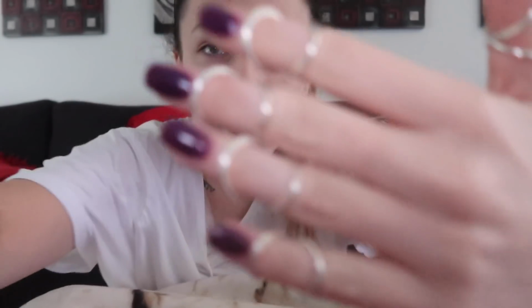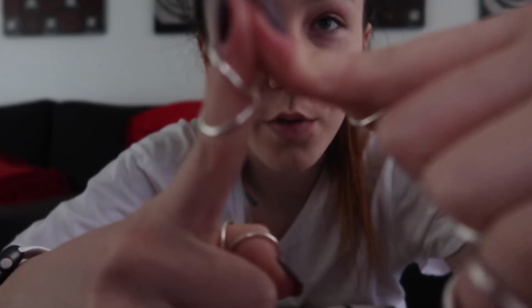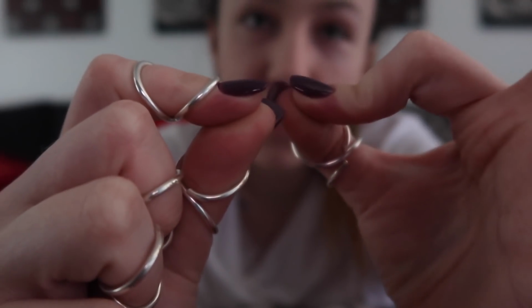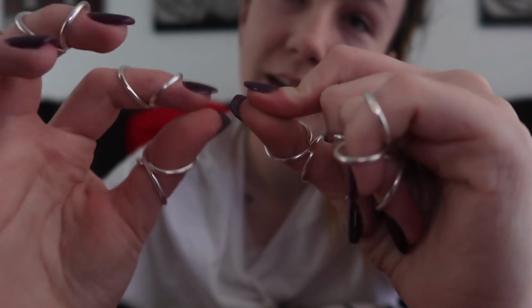Let me just show you them up close. I personally got mine made for these joints here. Let me show you. These joints, you see how it's bending that way? Well, I got those for that, so they're not gonna bend like that. As you can see, if I try and bend my finger, do you see the difference between what it normally looks like? This will dislocate super easily just because of how much it bends backwards. Whereas these joints, they are hypermobile, but not as hypermobile as these bits here. So as you can see, with and without. That is without, and this is with a splint. You just physically cannot do it. So I personally got my splints made for these joints, so they won't bend.